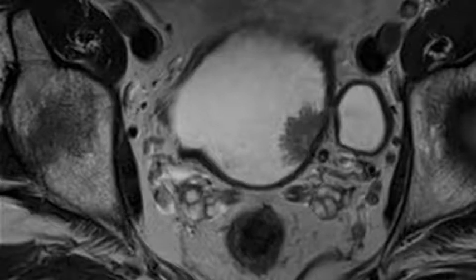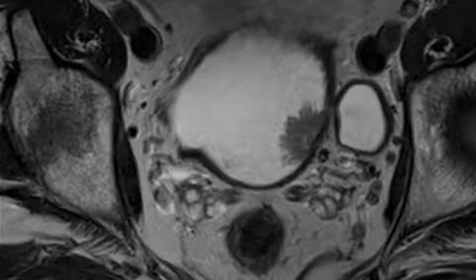Virtual cystoscopy has been performed with the installation of 300 to 500 milliliters of air or carbon dioxide into the bladder lumen via catheter.